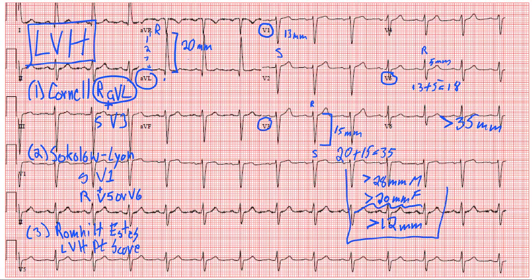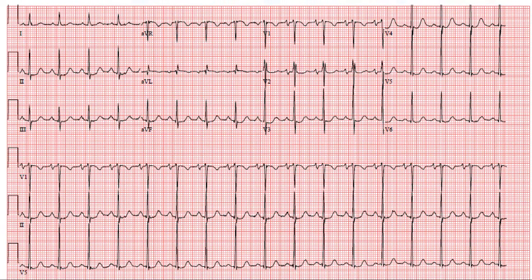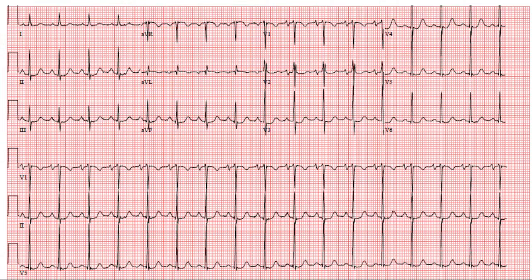We'll circle these here. So this EKG meets using the Cornell and the modified Cornell criteria, but not the Sokolow Lyon criteria. I do just want to go down to another EKG. This EKG, and you'll have to take my word for it, actually does not meet using the Cornell and the modified Cornell criteria. We can just look at it quick, right? So Cornell and modified Cornell, we look at AVL and then V3. And you can see here that the R wave in AVL, which is this wave, is quite small. And then the S wave in V3 is also not large, right? Because we needed it greater than 20 because she's a female, or greater than 12 for the modified. And it does not meet for either of those.